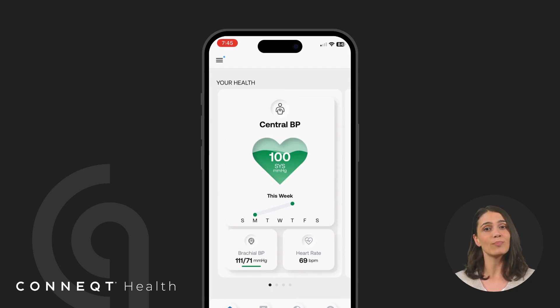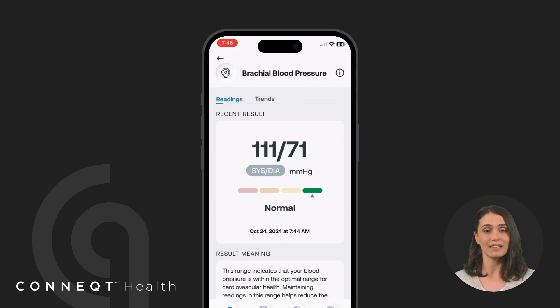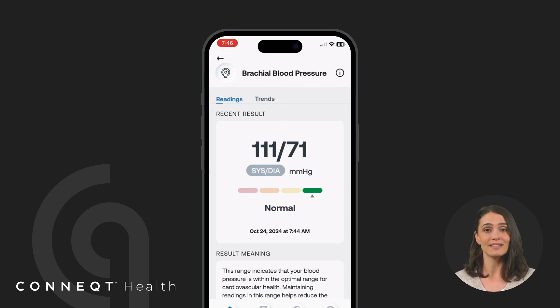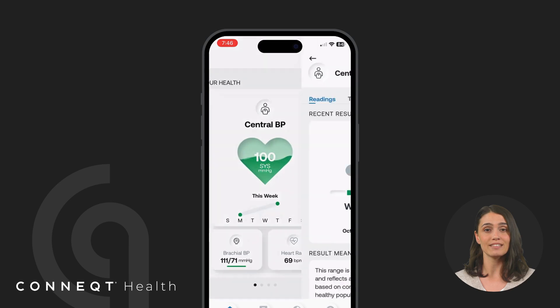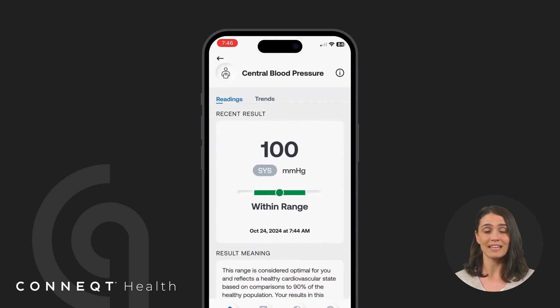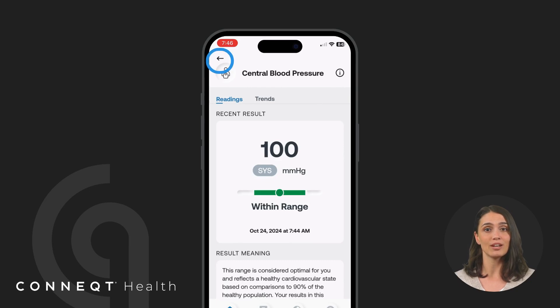The Connect app provides insights into seven important cardiovascular metrics. Brachial blood pressure is the pressure in the upper arm where the brachial artery is located, offering a general indicator of cardiovascular health. Central blood pressure measures the pressure in the aorta, the large blood vessel directly next to the heart, giving a more accurate assessment of cardiovascular risk compared to brachial blood pressure alone.